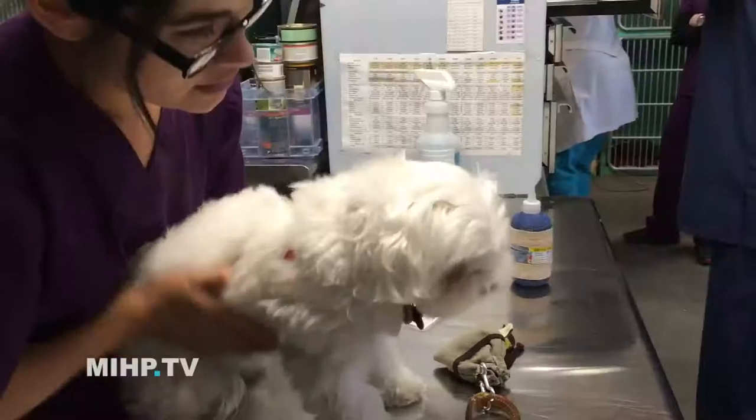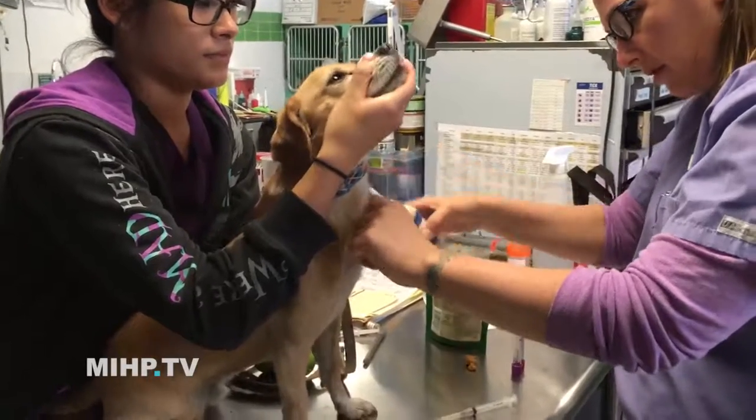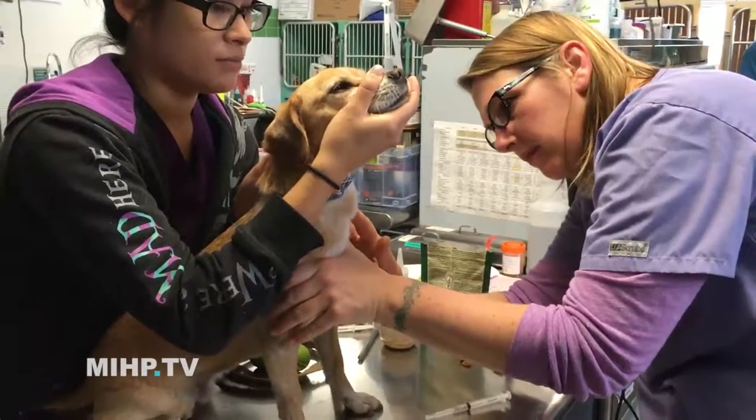How do we know where the vein is? In people, we don't have lots of fur, so you can see our veins. But in dogs and cats, they have all this fur, so how do we see it? Most of the time, what we'll do is we'll take some alcohol and just wet down the fur. Once that happens, we can just hold off the vein, and the vein bulges up just a little bit, and it's easy to feel and easy to see at that point.